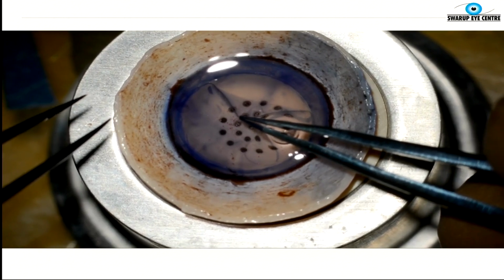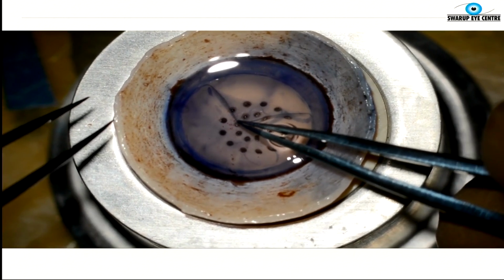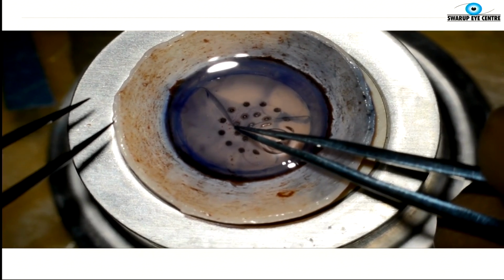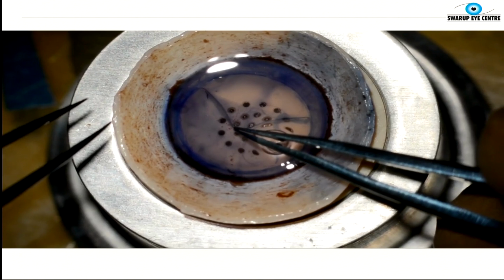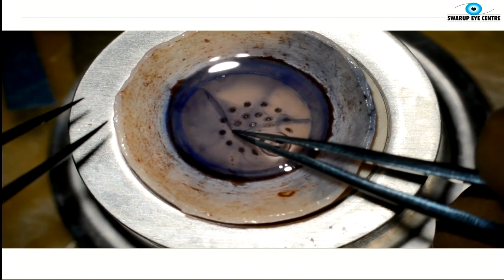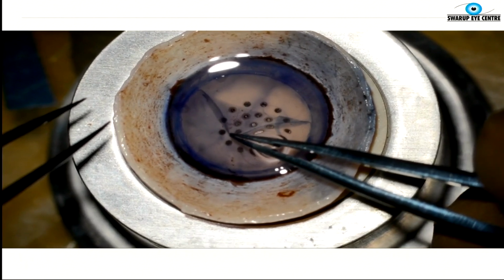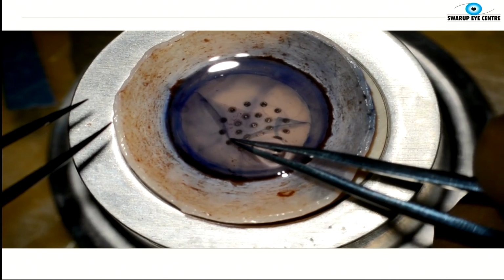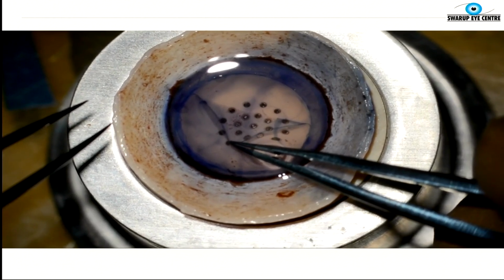So if you ever see an adhesion, try to go around it. Or maybe go from another area and come to that area in the end. Or you could use a little dissector and gradually try and separate that from the other side. So you can see I'm doing this very tentatively, gradually, as I'm watching this edge, slowly strip. You shouldn't strip the whole thing. About 2/3 is what you need to strip.